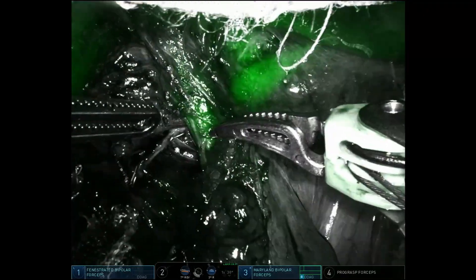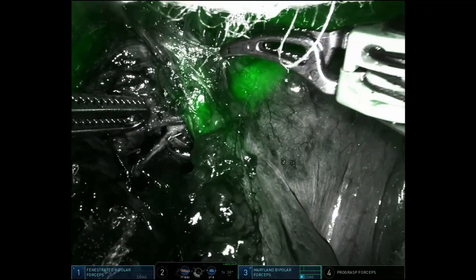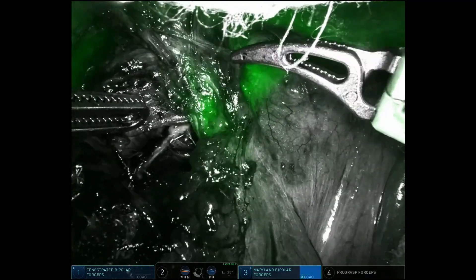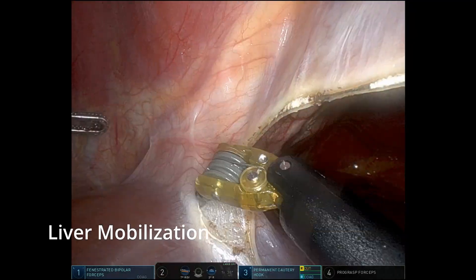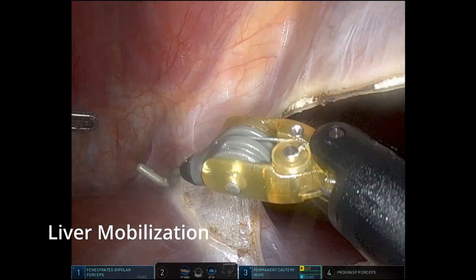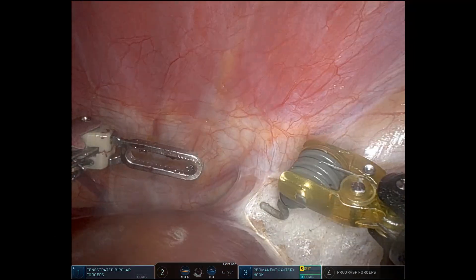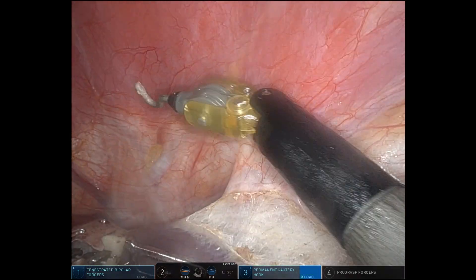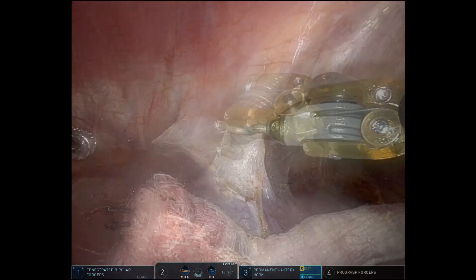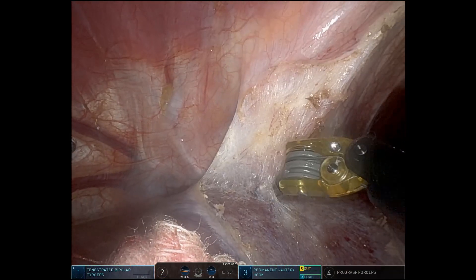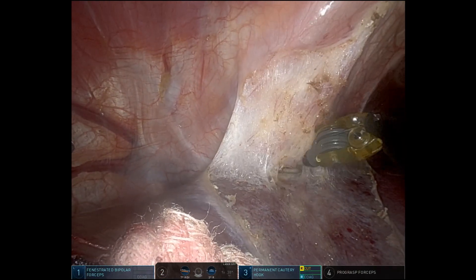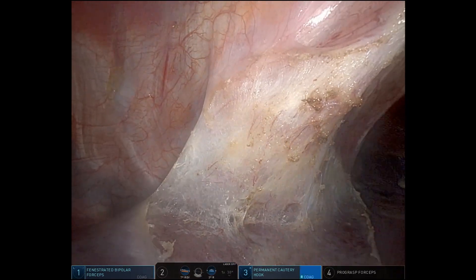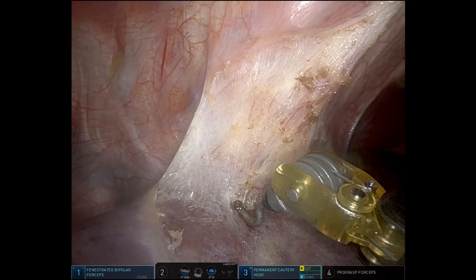Here you can actually see the bifurcation or the confluence of the right and left hepatic ducts. Now we're doing the liver mobilization. As you might have noticed before, we didn't do any mobilization until this point. Here we're dividing the falciform ligament, which we'll carry down to the right coronary ligament and also divide the right triangular ligament.